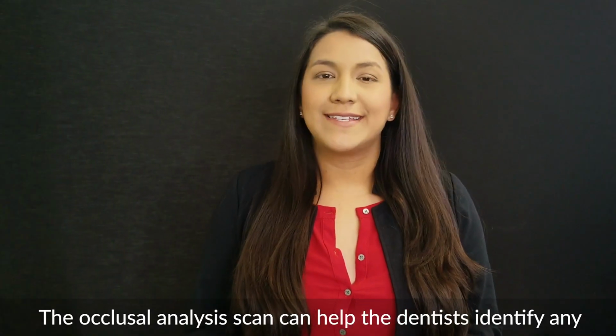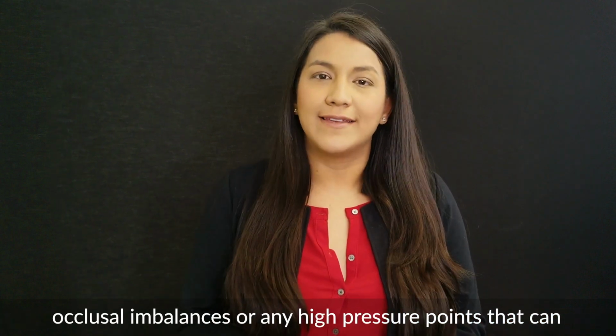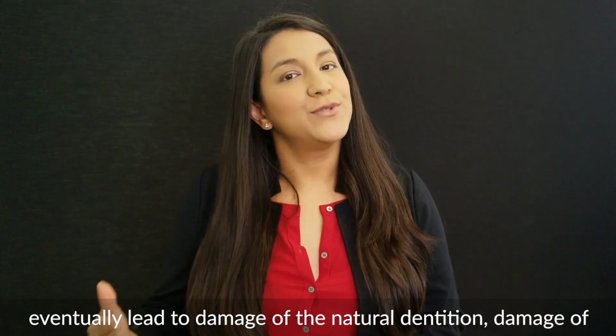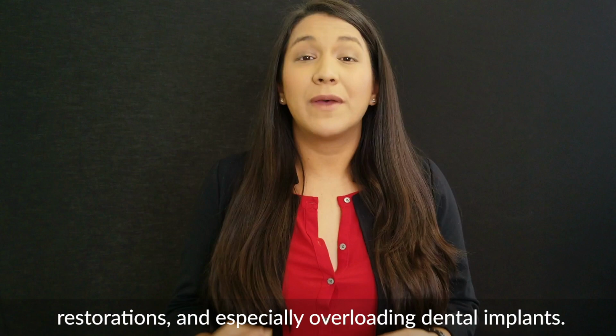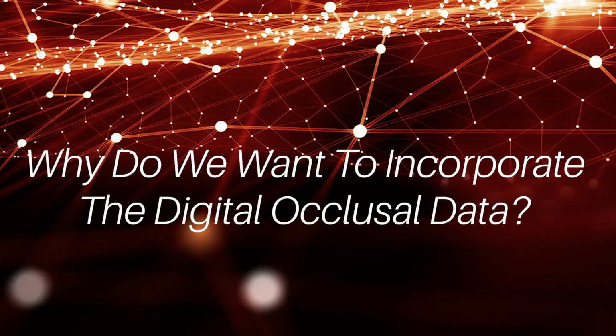The occlusal analysis scan can help the dentist identify any occlusal imbalances or any high pressure points that can eventually lead to damage of the natural dentition, damage of restorations, and especially overloading dental implants. Why do we want to incorporate the digital occlusal data?